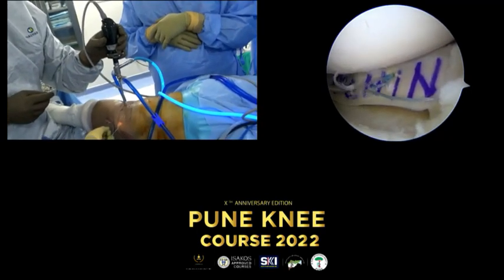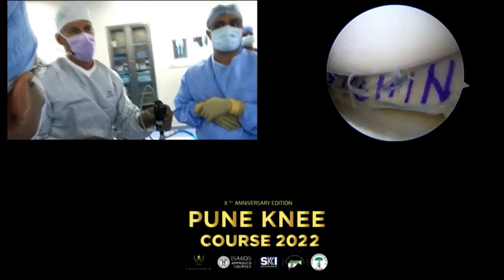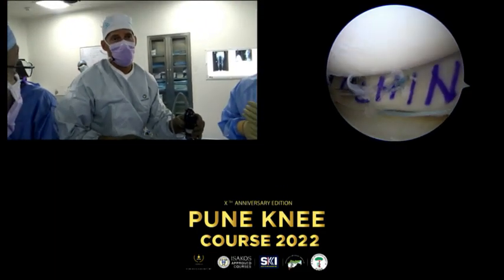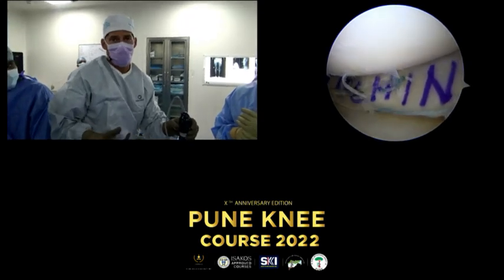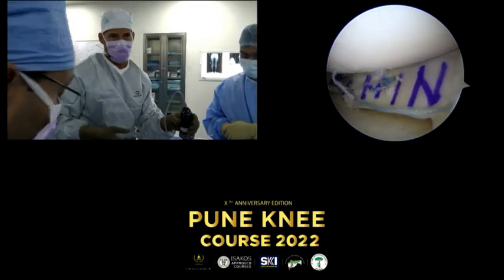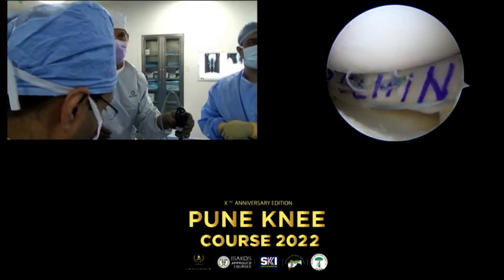Any particular angle of flexion where you will fix the roots? At what angle of flexion will you fix the posterior root and the anterior root? No, at the end it's not important because the relationship is everything around the tibia. I don't do it in hyperflexion, just between 0 and 90 degrees. There's not much difference because at the end it's going only through the tibia.